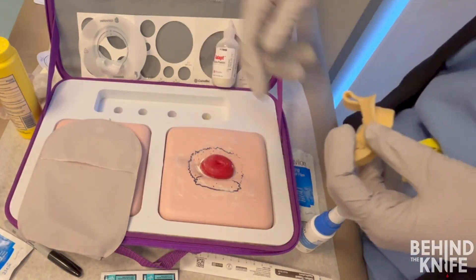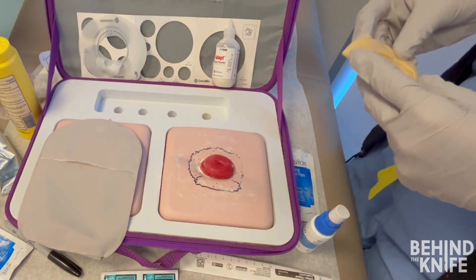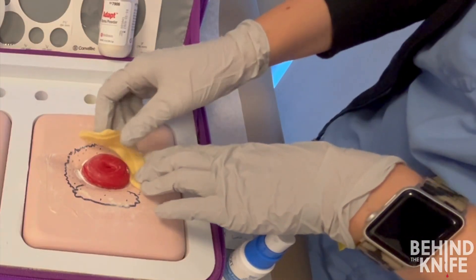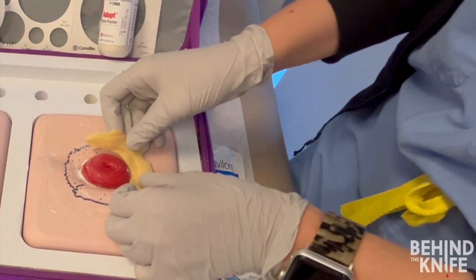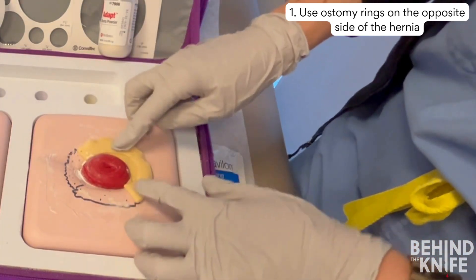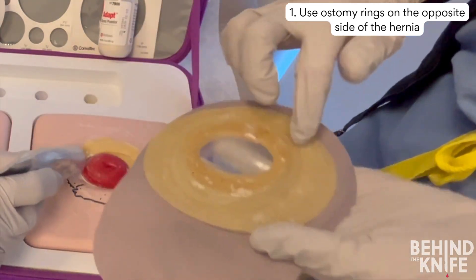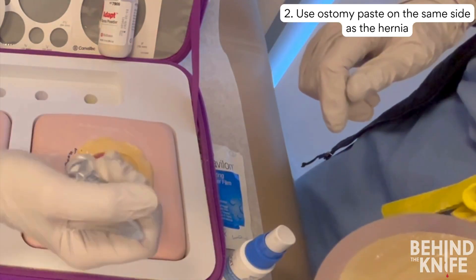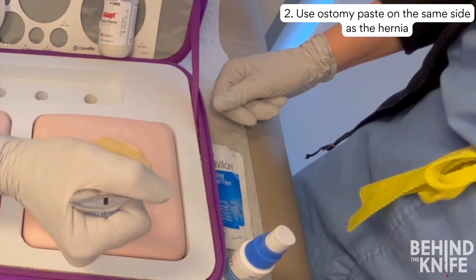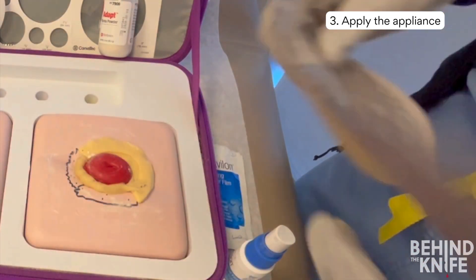The tip for pouching an ostomy with a peristomal hernia is to flatten your landing zone as much as possible. You will need to use ostomy rings to build up the low areas to match the height of the hernia. In this example, we fold an ostomy ring in half to create a thickened band of material. Apply the ostomy ring to the side opposite the hernia to build up the abdominal wall, and use ostomy paste on the other half. When you press the appliance into the abdomen, the paste will flatten out but the rings will hold their structure, helping you create a flat landing zone and a circumferential seal around the stoma.